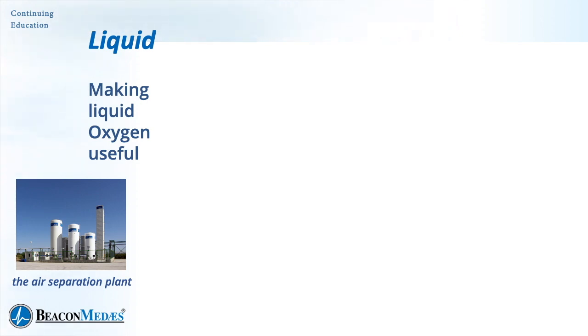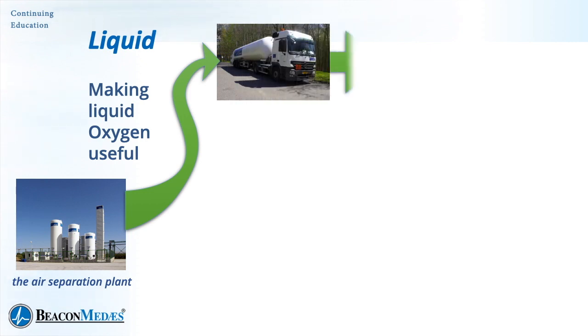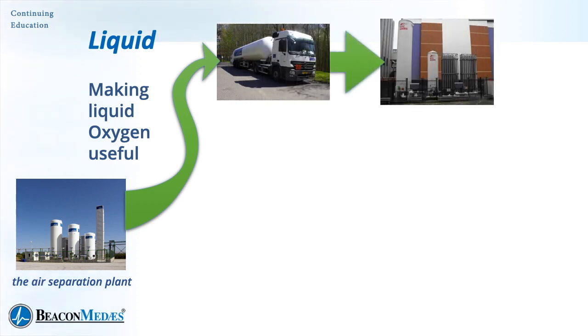Now we have liquid oxygen, that's very nice, but we have to make it useful, which means we have to put it on a truck, haul it to our facility, fill that big white tank, and that's how we will get liquid oxygen and use it in our facility.